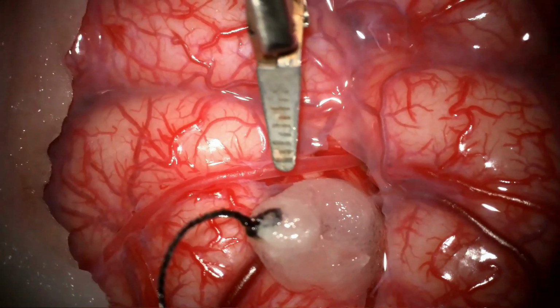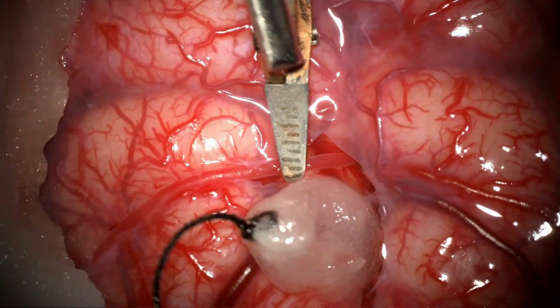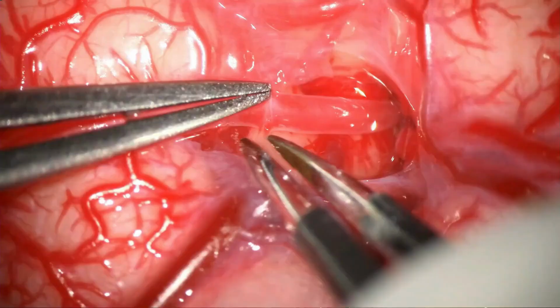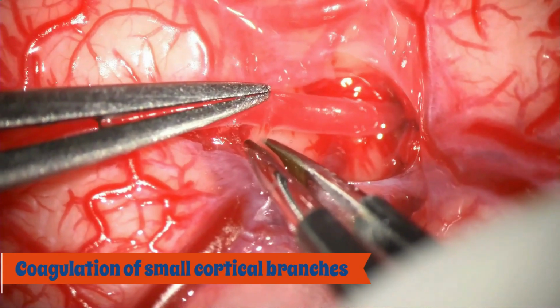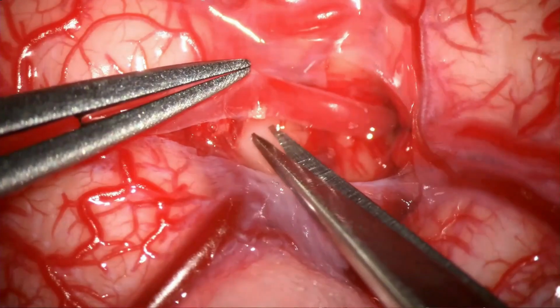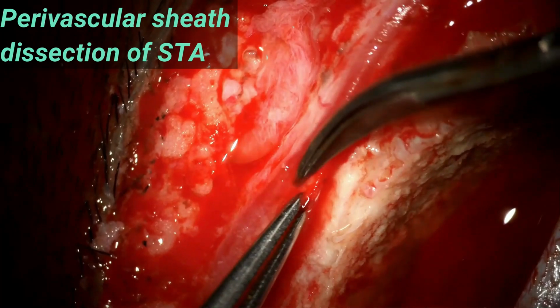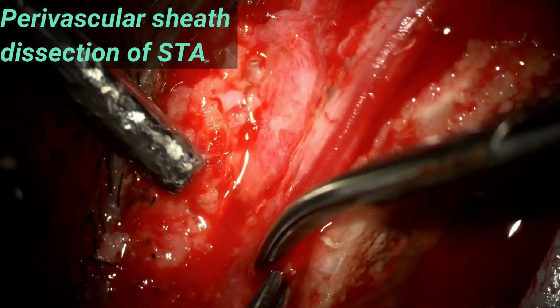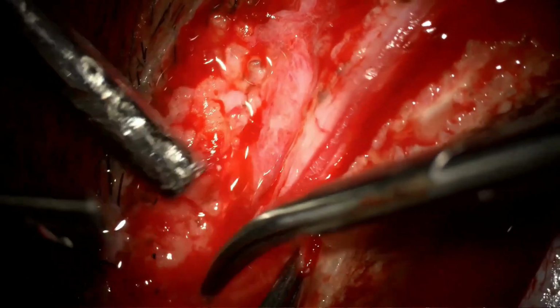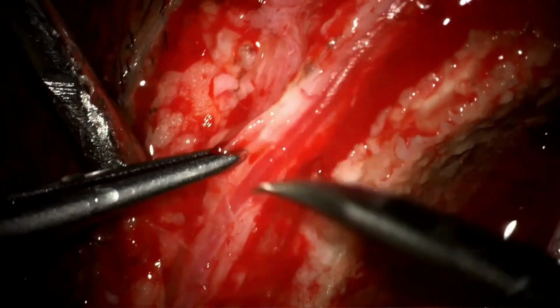The diameter of this M4 vessel is approximately 0.7 mm and it is chosen as the recipient vessel. Small cortical branches are coagulated to free this artery, for the purpose of passing a background sheet underneath and to prevent influx of blood in the lumen during the anastomosis. The perivascular sheath is sharply dissected off the STA to free an adequate length to prepare it for anastomosis.